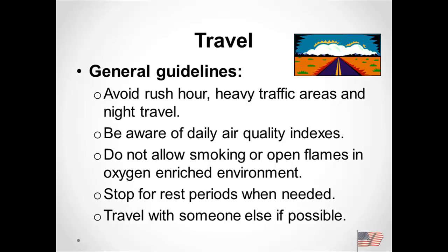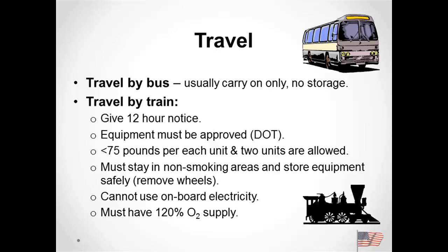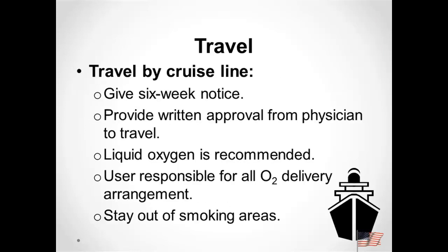Travel, again, just common sense things that the patient should be aware of. Stopping for rests. Travel by car. We talked, I think, a little bit about this. Make sure the cylinder doesn't roll. Travel by bus. Go to Greyhound or train. By a cruise line. There you go.